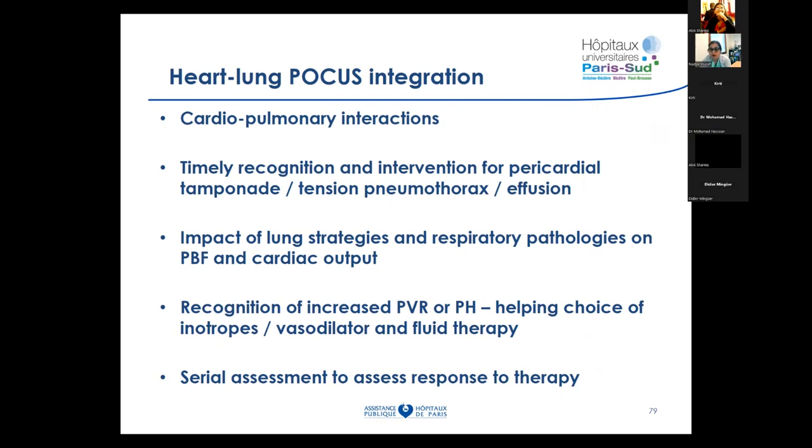And we are in a situation where we often have hypoxic babies in the beginning, and many of us have the tendency to ventilate the baby, give surfactant, and do stuff like this if the baby is preterm. But you've seen the patterns on lung ultrasound. If you have a normal or almost normal or not very sick lung with a very hypoxic baby, of course, our European recommendations say we have to give surfactant if the FiO2 levels are above 30%, et cetera, in the tiniest babies. But it doesn't make sense to stop there.